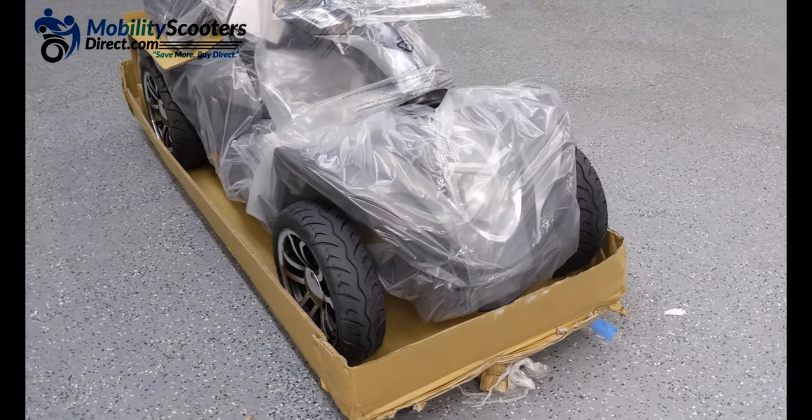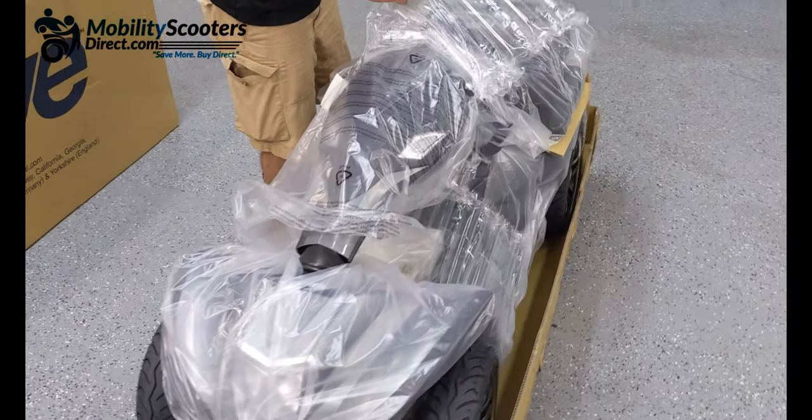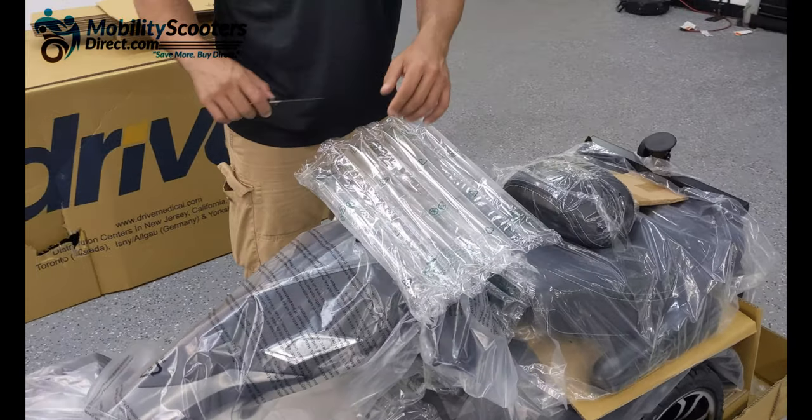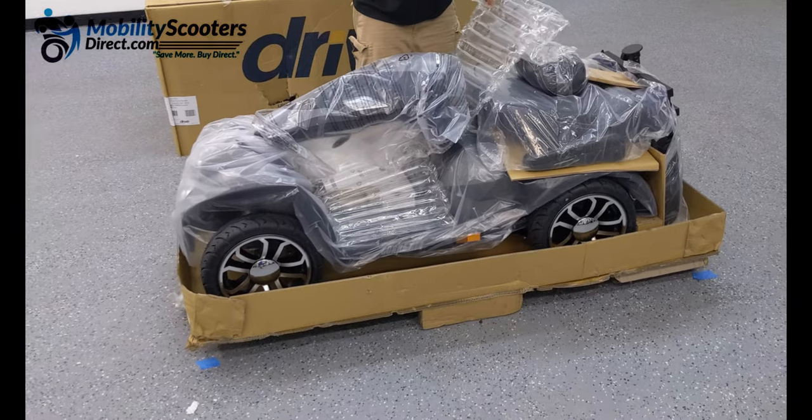The Cobra scooter goes up to 10 miles per hour and has a travel range of up to 22 miles on a full charge. It can support up to 450 pounds. It's a very impressive heavy-duty mobility scooter by Drive Medical.